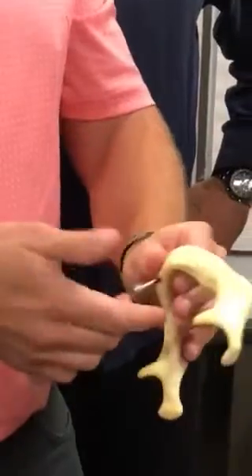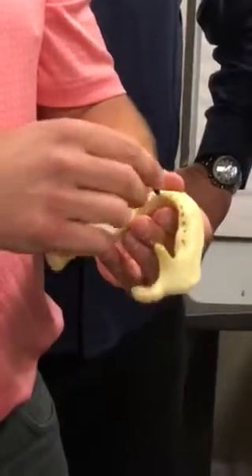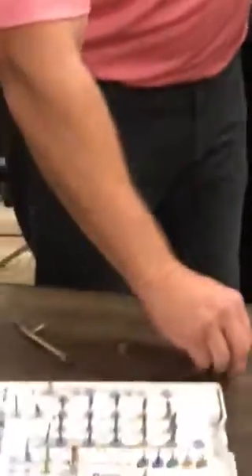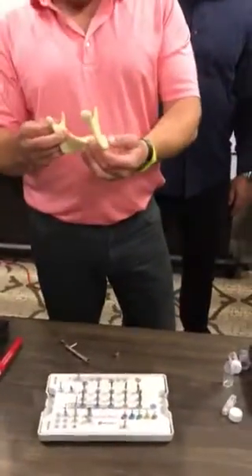That's a 2-0, and this sucker's tight right now. I'm hurting my hand. I'm going to stop because I want to get a measurement of that. But I want you guys to see — this is important to know how it acts in the bone.